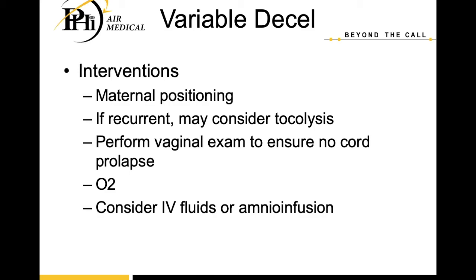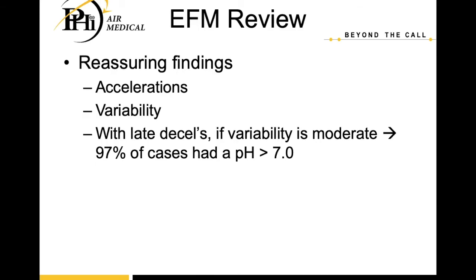We're going to give mom some O2, and then we're going to consider IV fluids, or even maybe an amnioinfusion if that's the problem, if they have that issue. Reassuring findings on an EFM.